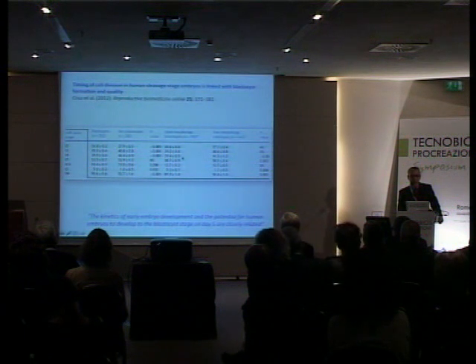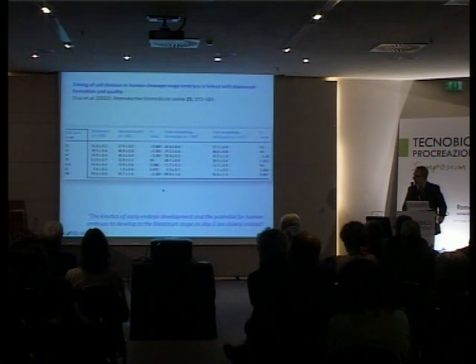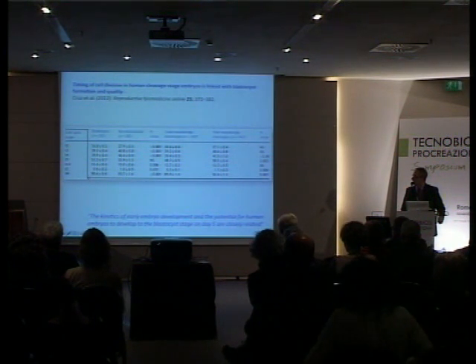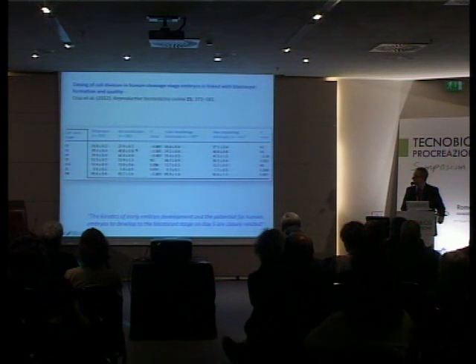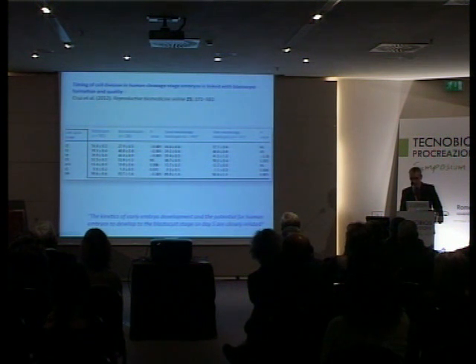And this is more or less what other people have found more or less at the same time recently this year. It's the EV group, and they also observed a difference in times between non-blastocyst and blastocyst, in favor, of course, of a faster cleavage for the blastocyst embryos with the blastocyst capability, and the same applies to good morphology blastocyst versus poor morphology blastocyst.